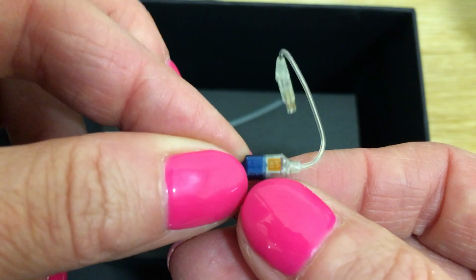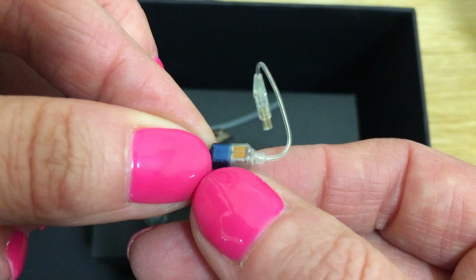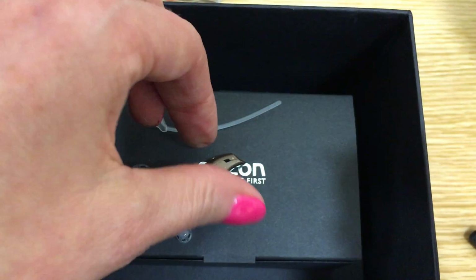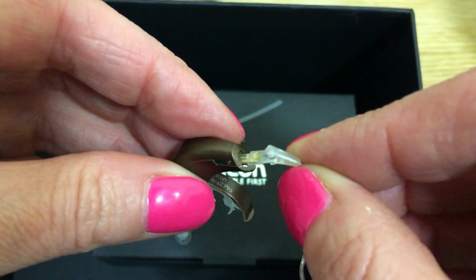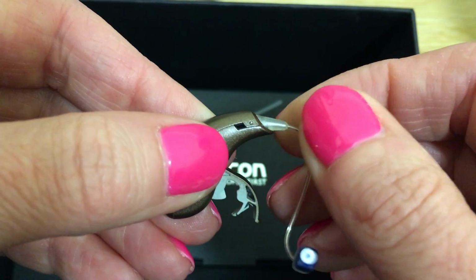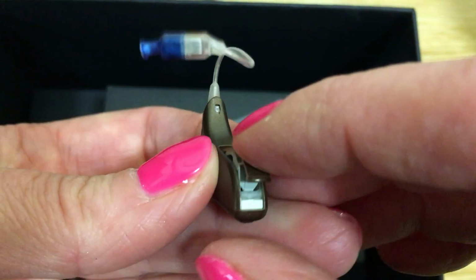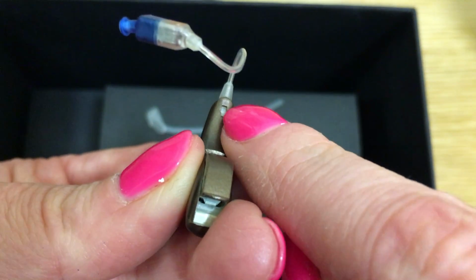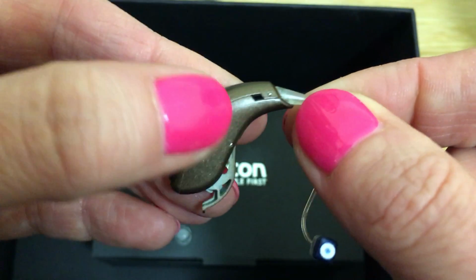Here we can see the small marking 85, indicating that this is an 85 decibel speaker. The speaker is plugged in to the neck of the instrument. It clicks in and locks into place. If one needs to remove the speaker, we insert a small tool here to release the lock, which unplugs the speaker.